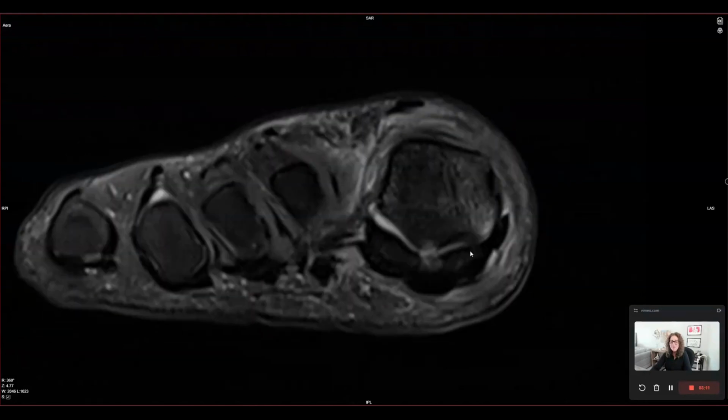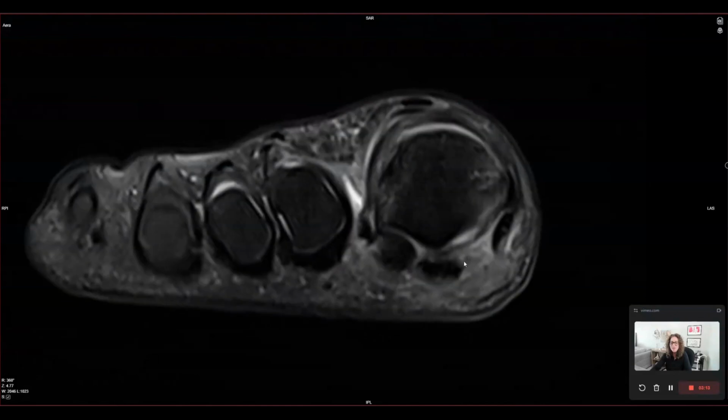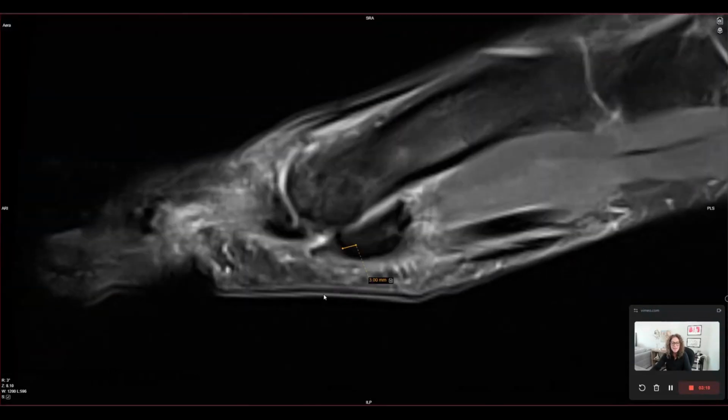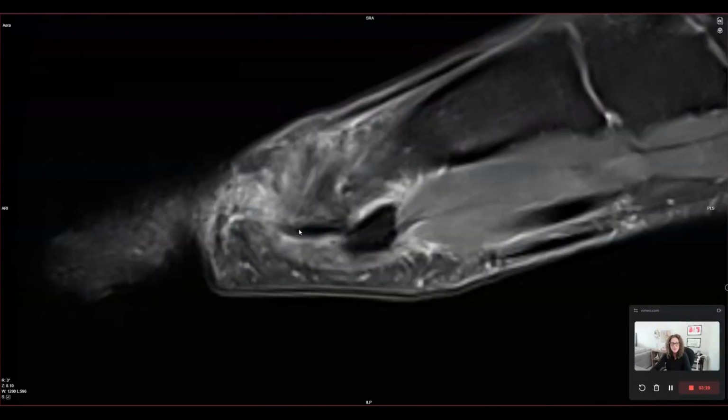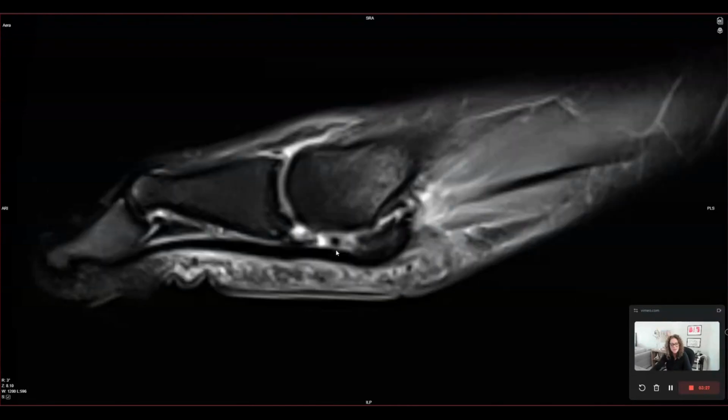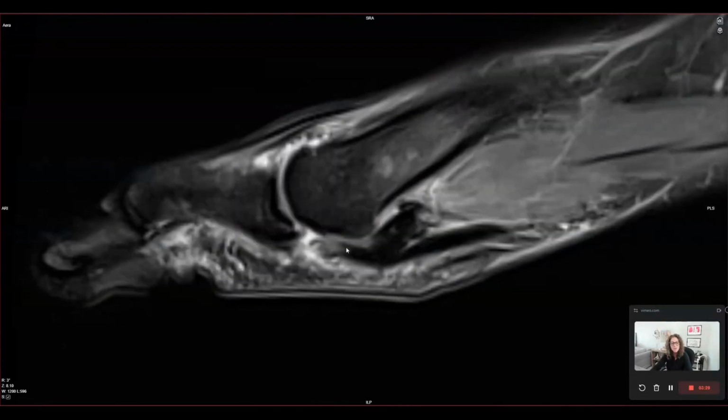What we can see from the sesamoids to the proximal phalangeal base is that there's a fluid-filled gap, and we can appreciate the tear of the sesamoidal phalangeal ligament as it goes through that entire region of gap between the sesamoid and the proximal phalanx on the medial side. Moving to the lateral side, we can also appreciate the torn edges of the sesamoidal phalangeal ligament as the fluid traverses through the full thickness defect.